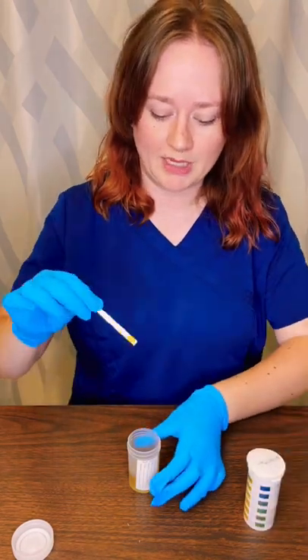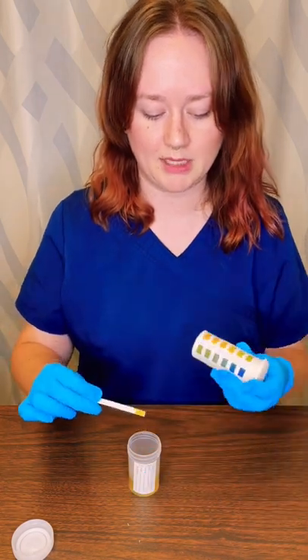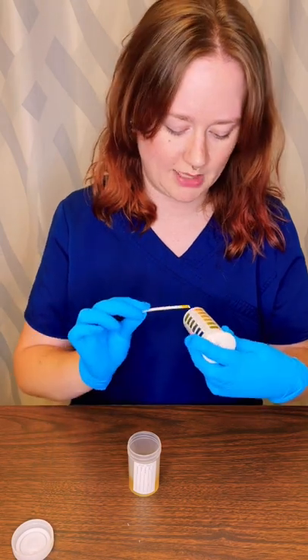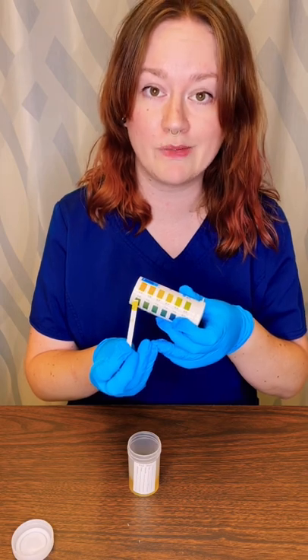So I simply insert the dipstick into the urine and then I immediately compare it to the colors on the side of the tube. So for example, this one mostly matches that first one, so the pH is 5.5.